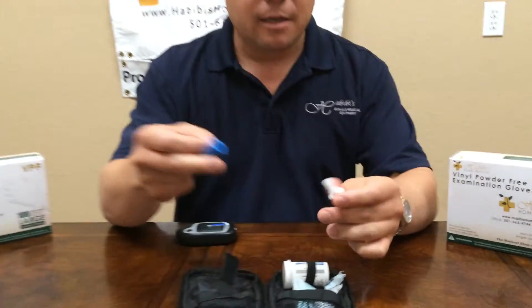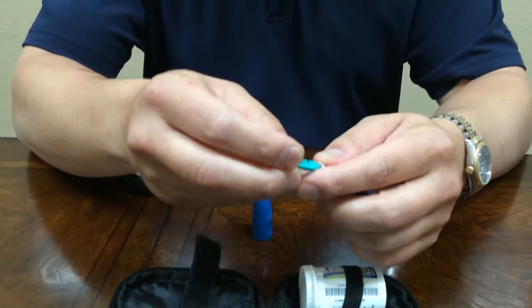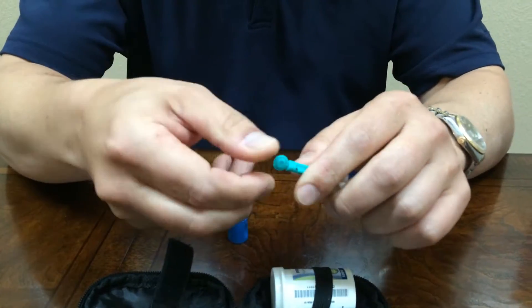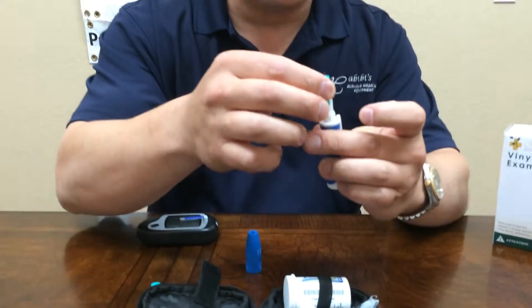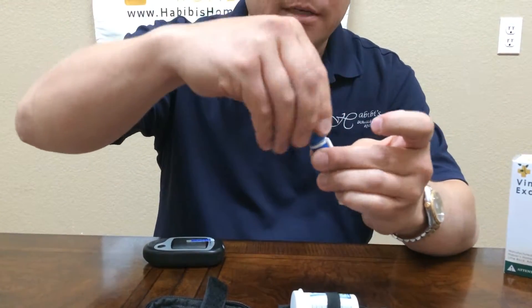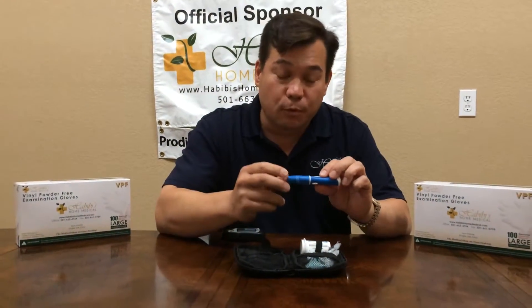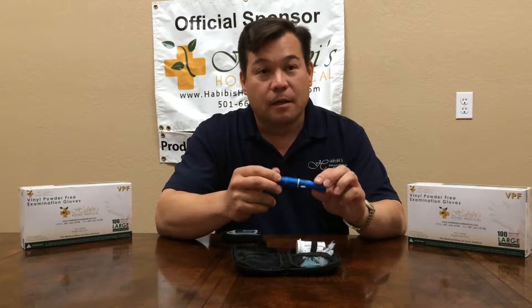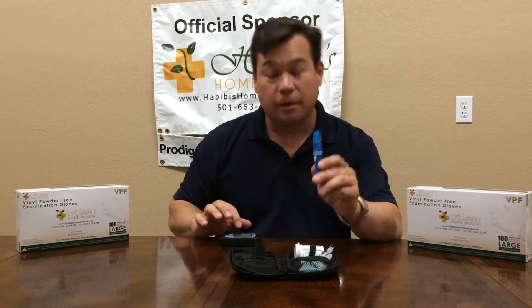To load the lancet injector, I've always found that it's easier for my visually impaired patients to put a finger around the top of it, line it up, and slide it in. To cock the meter, it is also easier to directly push the plunger back. We put the top on and screw it tight. This is set to five. The reason we generally like to go to the deepest setting on the lancet injector is that due to the visual impairment, it's often times much harder to get the bead of blood onto the end of the strip.